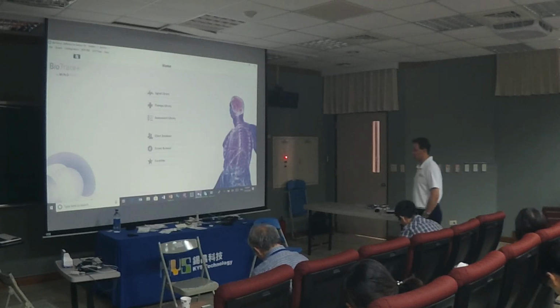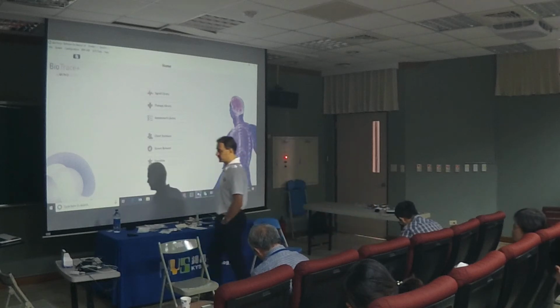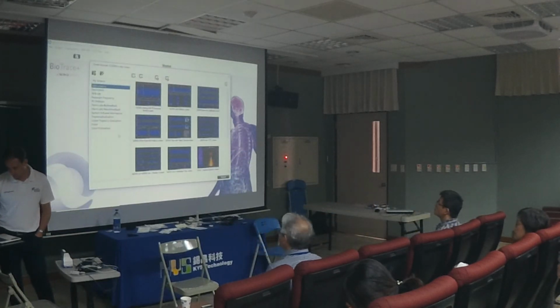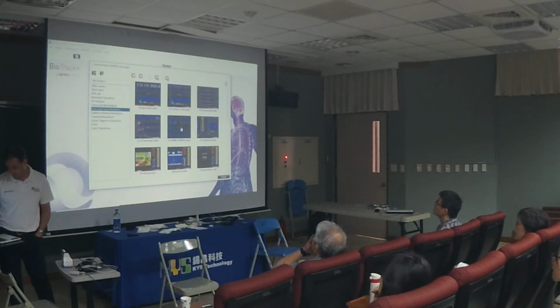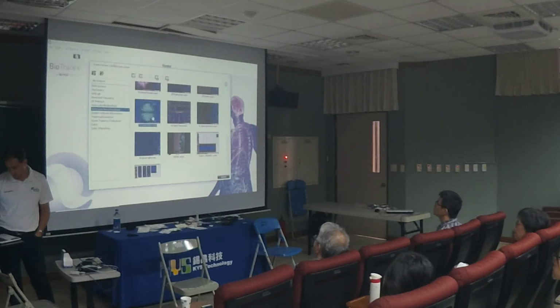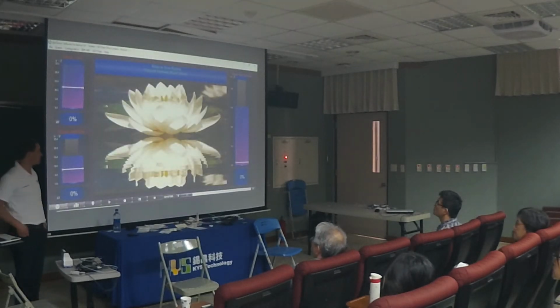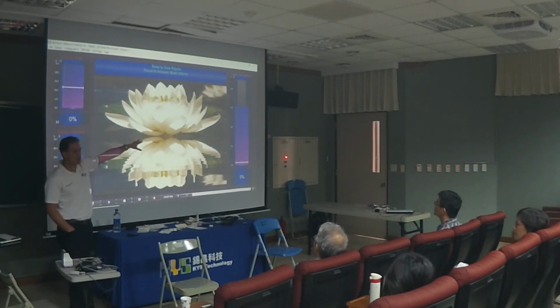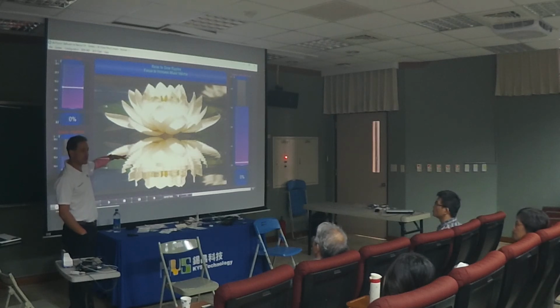Sometimes you need to use simple things. So, for example, you can use that screen right there. And what is it? You're down training the theta, you're down training the high beta, and you're choosing what you want to up train, right? The idea is for the water to be as still as possible, right?